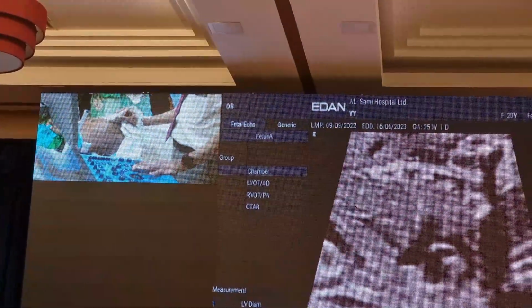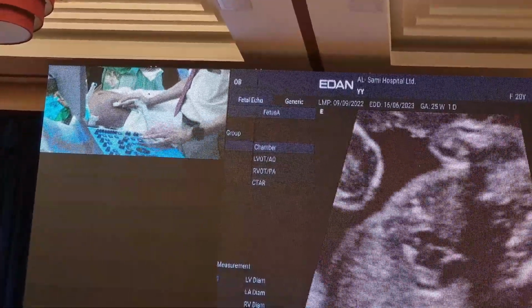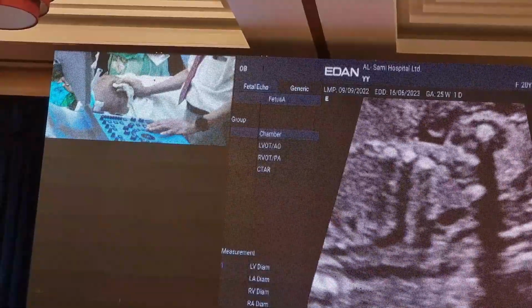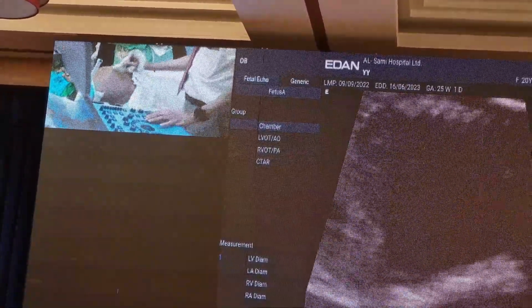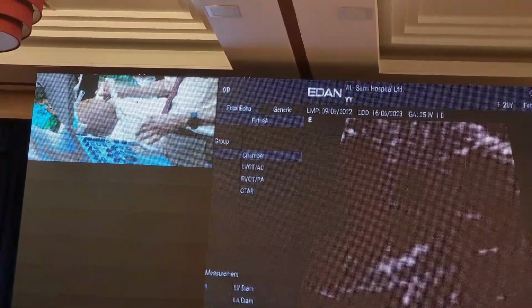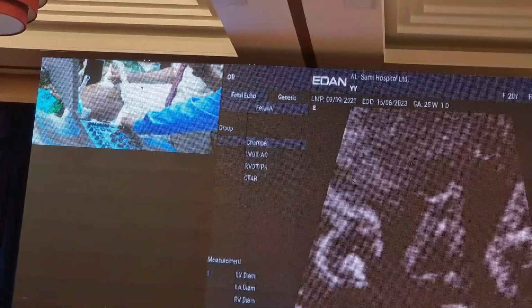Whereas the ductal arch comes from the right ventricle, and because it comes from the right ventricle, it has to travel a larger distance, and therefore it is usually very broad. It's a broader sort of an arch. So let's see if we can get a ductal arch. Zoom out again. Zoom out.